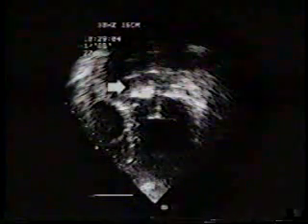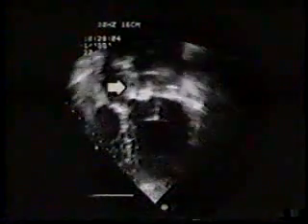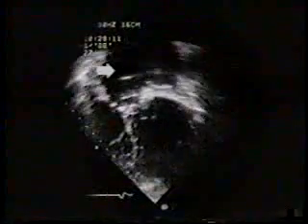Aortic prostheses are typically more difficult to image than mitral prostheses. Poppet motion is identified via the to and fro motion of the mass of reverberations within the aorta.